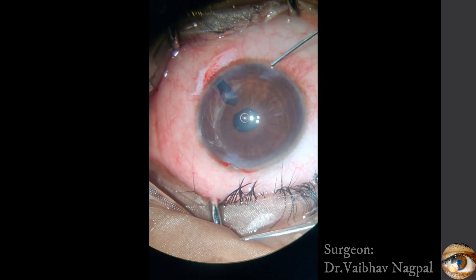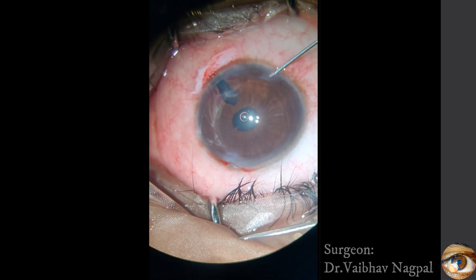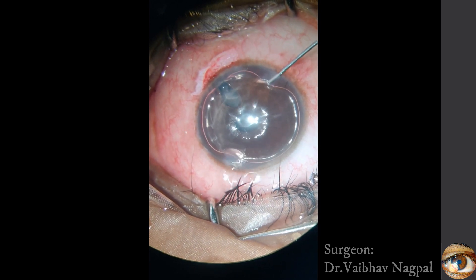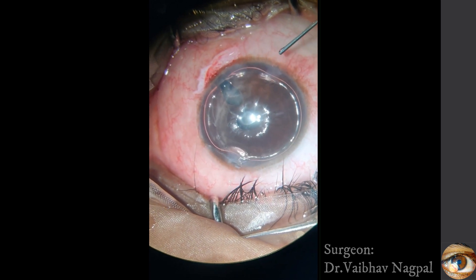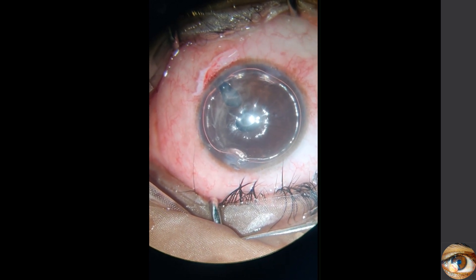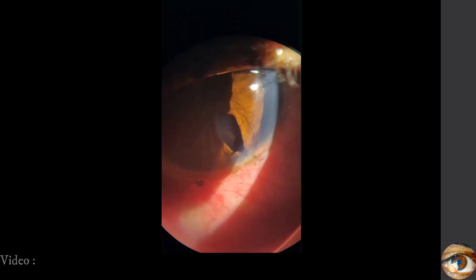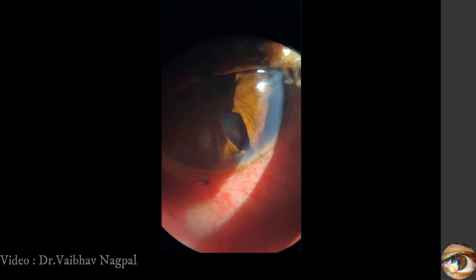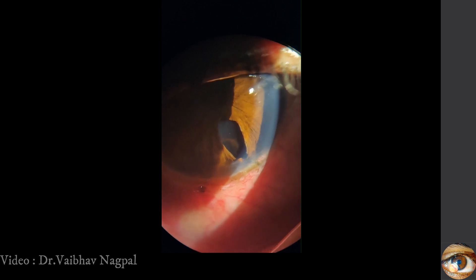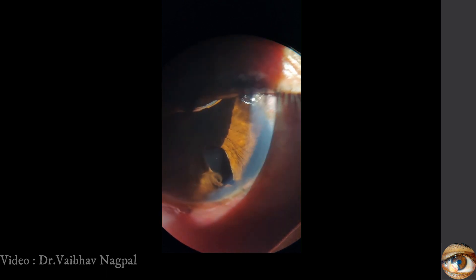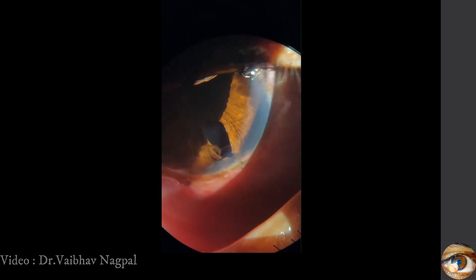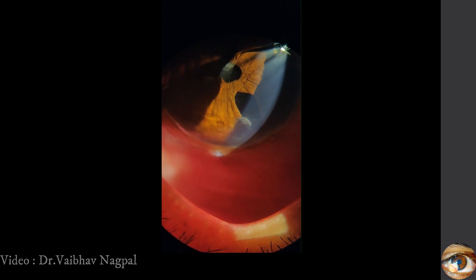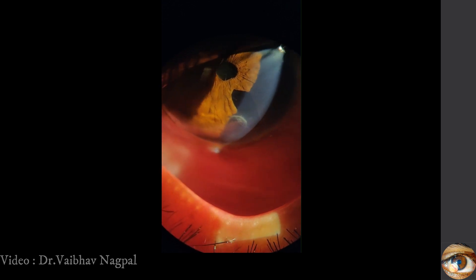An air bubble is injected into the anterior chamber, and the limbal incision is sutured. The case is done. We can see the 10-0 nylon suture at the limbal incision. The chamber is well formed and there is minimal anterior chamber reaction.